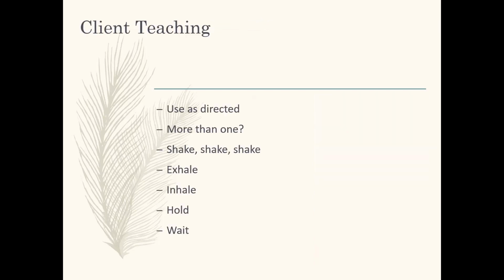Last thing is client teaching. It's very important that the client knows why they need this medication. It's important if they know if it's a short-acting medicine or a daily longer-acting medication. So when you listen to the oxygenation information, there's some medications that they will start working very quickly. That's for clients that are experiencing trouble breathing right now. They can take that medicine and it's going to help fast.